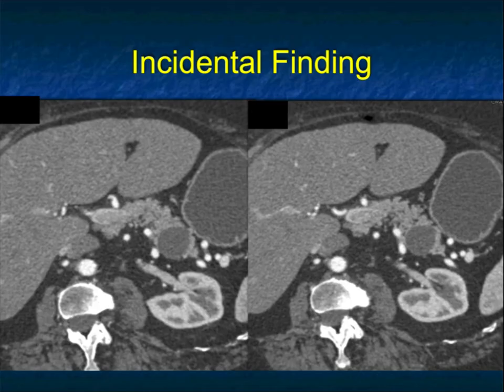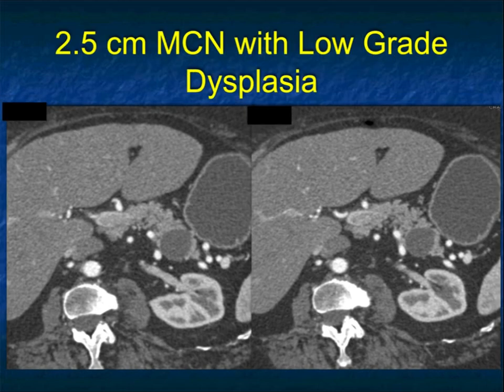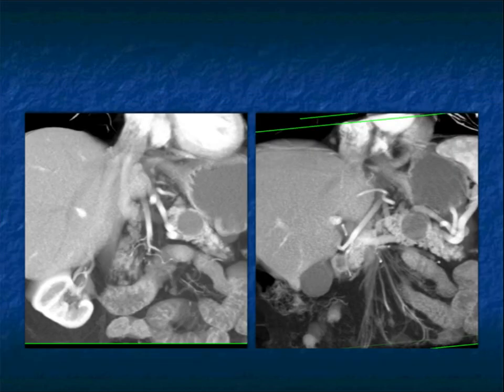Look at the appearance. Now, some patients have symptoms — vague abdominal pain. Other patients, like this one, are incidental findings. This is the one I'm thinking about: an IPMN, but I don't see a pancreatic duct. So the location makes me mention MCN in the differential diagnosis. This was a 2.5 cm MCN with low-grade dysplasia.